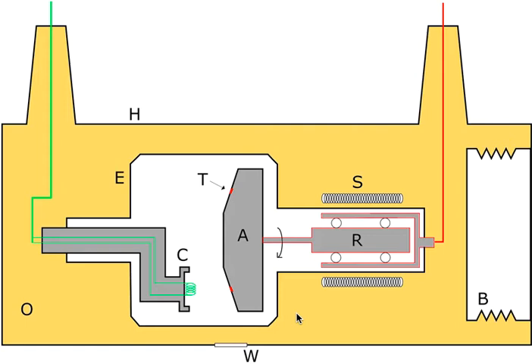So that covers the basics of our X-ray tube. To recap, we have a filament which has electrons. We heat that and this process creates thermionic emissions. Those electrons go across the potential towards the positively charged anode. This is the process that we use to create X-rays, which are photons. Just remember that 99% of this is wasted into heat and only 1% is what we're actually able to use.